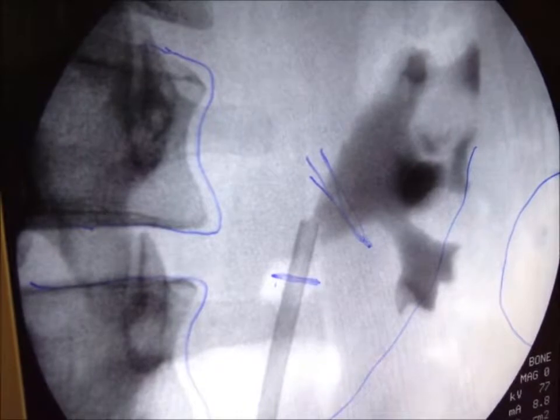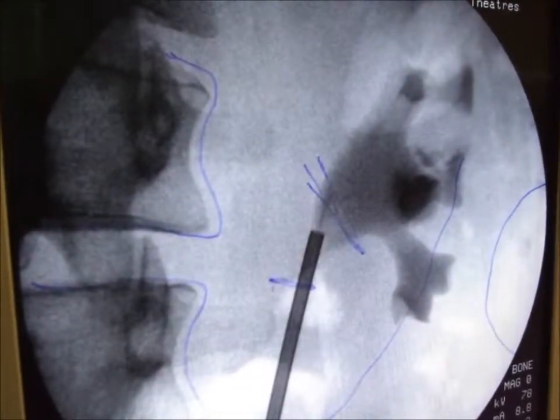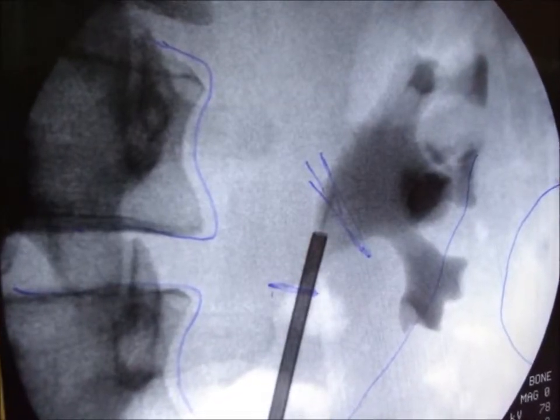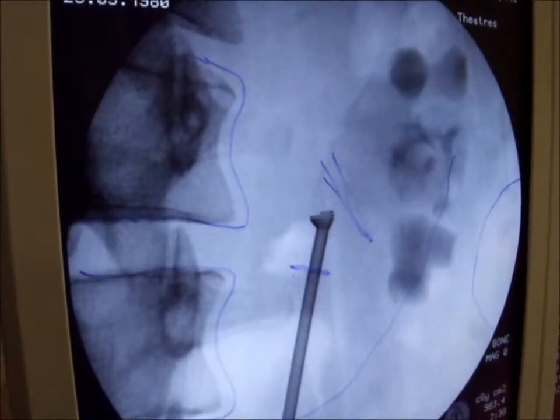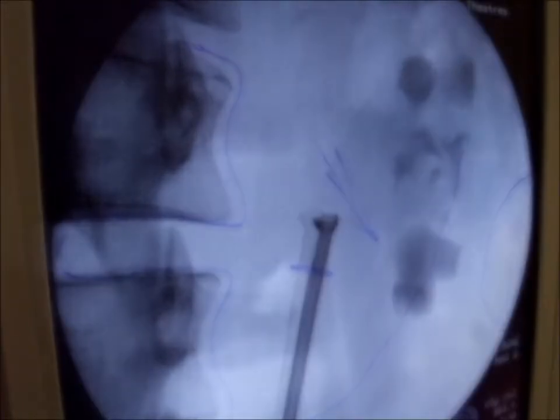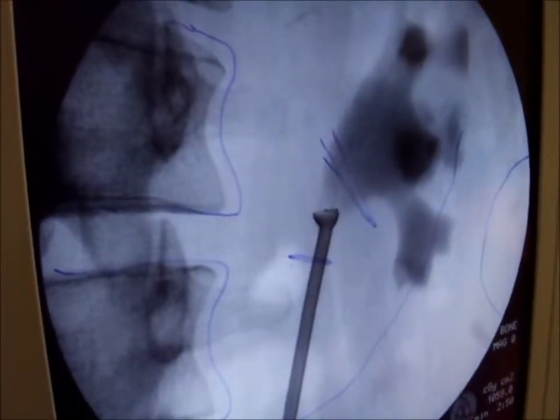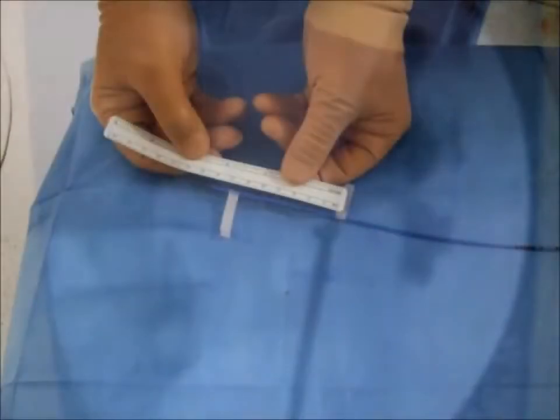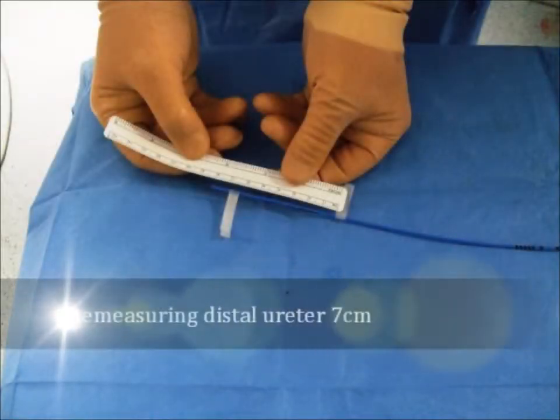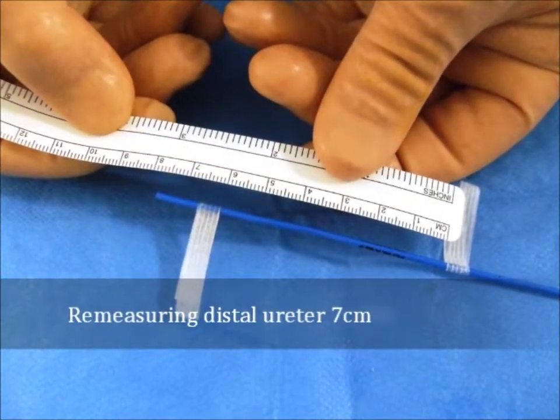Firstly, the stent introducer is advanced to the left pelvic-ureteric junction, and the 150 mm MAMOCAT 051 is expanded there with 55 degree Celsius hot water and anchored in the PUJ. The proximal stent was chosen as long as possible to increase the friction between the stent and the ureteric wall and so prevent upwards migration. The remaining unstented distal ureter is re-measured and confirmed as 7 cm in length.